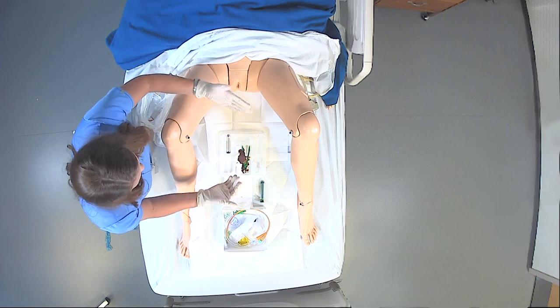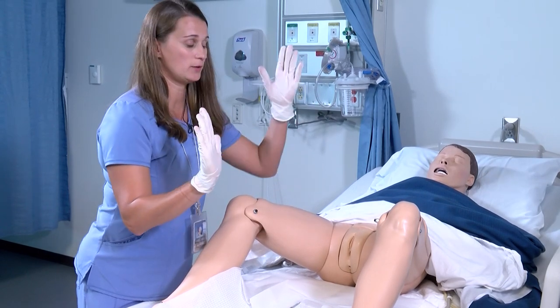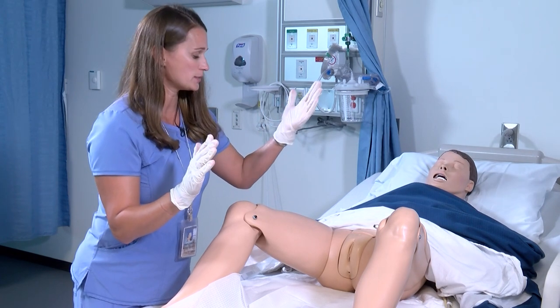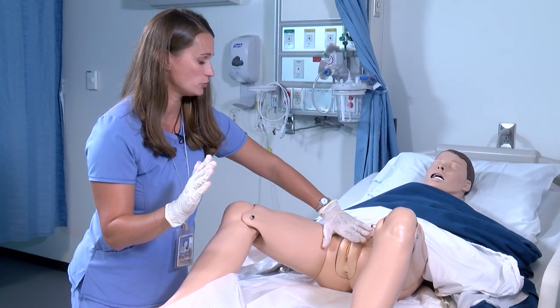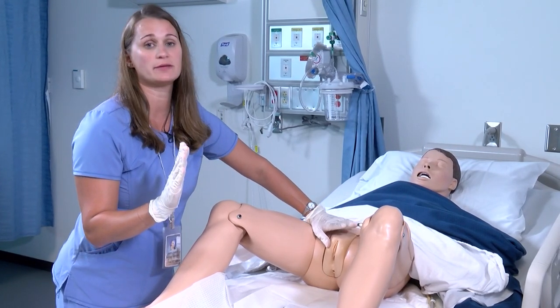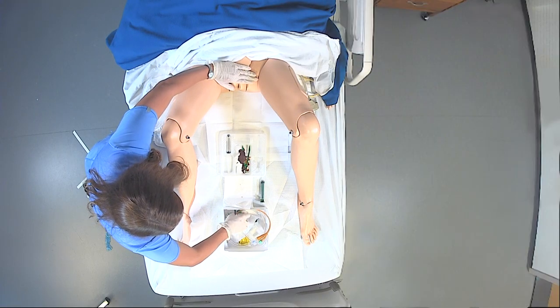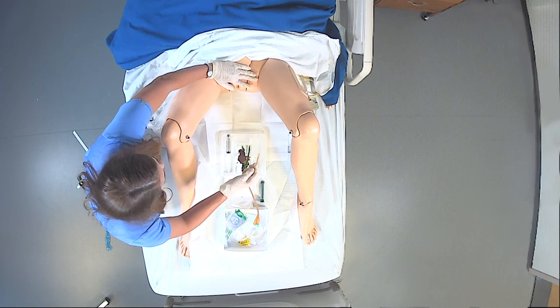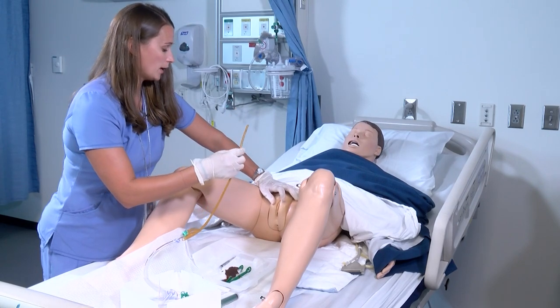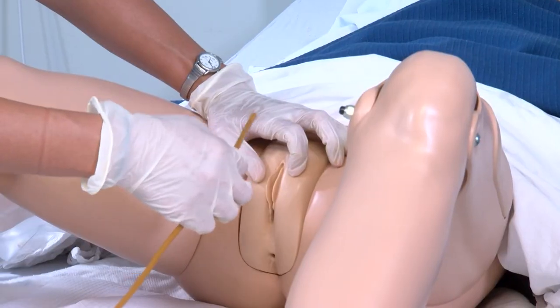When you place a Foley, you have one sterile hand and one non-sterile hand. This is very important to be cognizant of, because as you put your hand on the patient to hold their genitalia, you want to make sure that hand never leaves the patient again — it is now contaminated. As you grab your Foley and lubricate it, make sure you lubricate it really well and don't contaminate it by touching your hand or anything else.